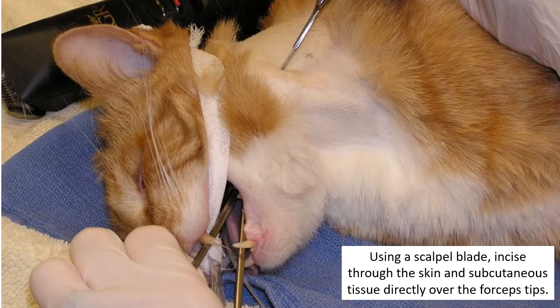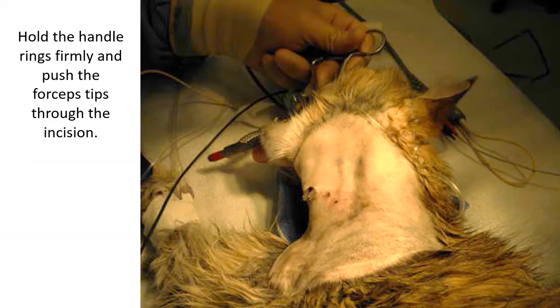So there is this concurrent pressure from the scalpel to incise over the forceps, and there is this pressure from the forceps handle to bring the tips up. Hopefully, that will be enough for you to bring the forceps tips out of the skin incision. Hold the handle rings firmly to prevent accidental unlocking and push the forceps out through the incision. As you can see, the tips are seen here, exiting the skin incision.